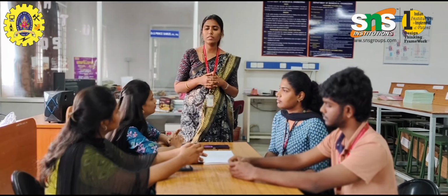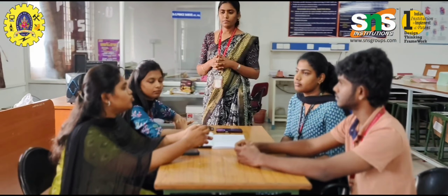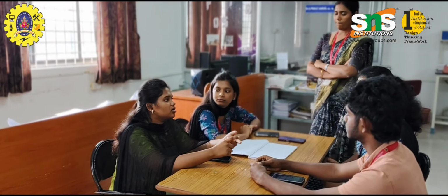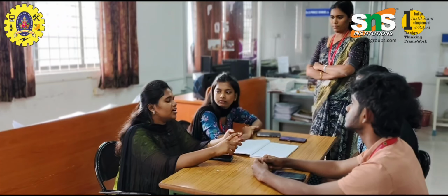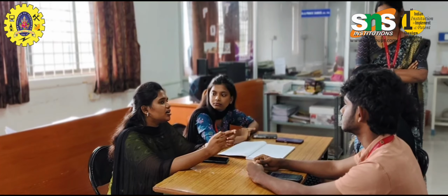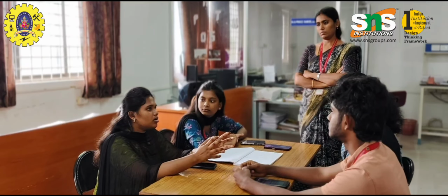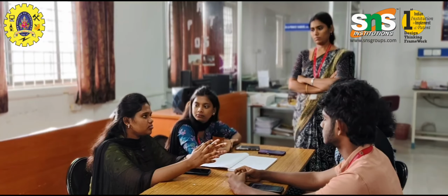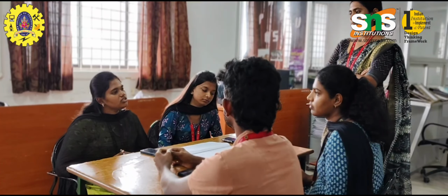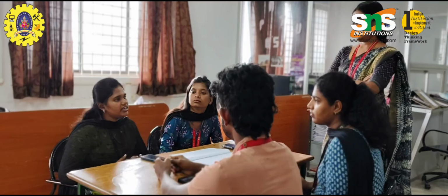Then we will move on to what are the different modes which are being used in an ESU unit. Can anyone explain? Yes, there are two modes in electrosurgical units. Firstly, we are going to see about cut. The electrosurgical unit delivers a high frequency current, reaching above 100 degrees Celsius.